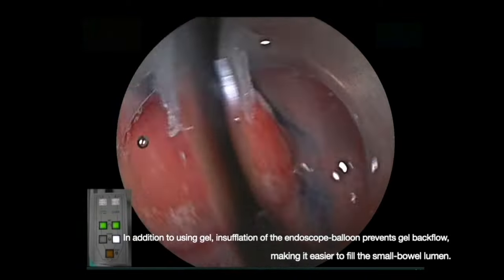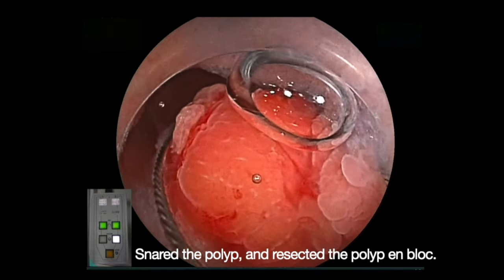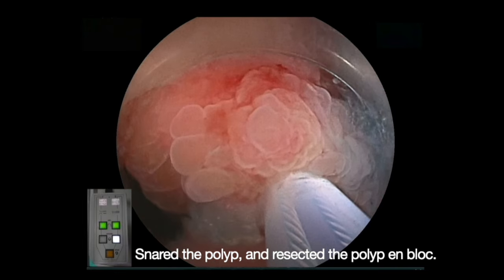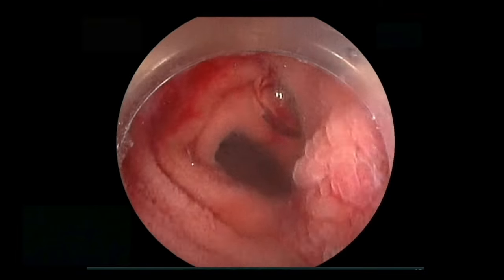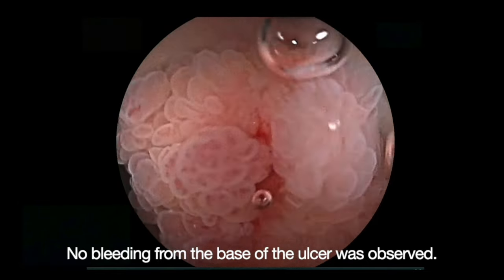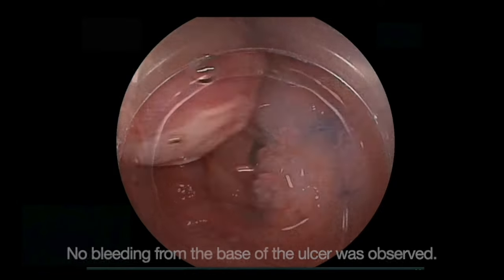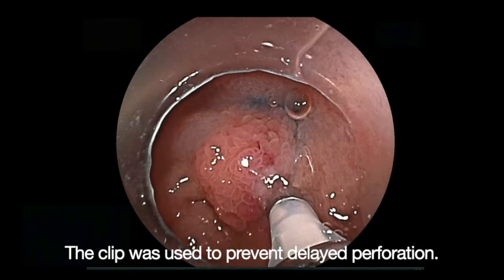We opted to use gel. In addition to using gel, insufflation of the endoscope balloon prevents gel backflow, making it easier to fill the small bowel lumen. We snared the polyp and resected it en bloc. No bleeding from the base of the ulcer was observed, and a clip was used to prevent delayed perforation. There were no adverse events.